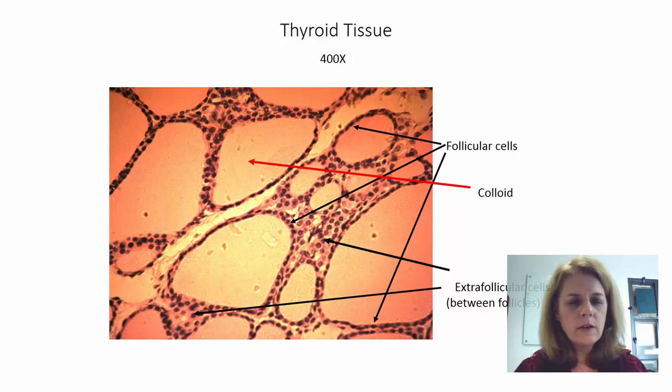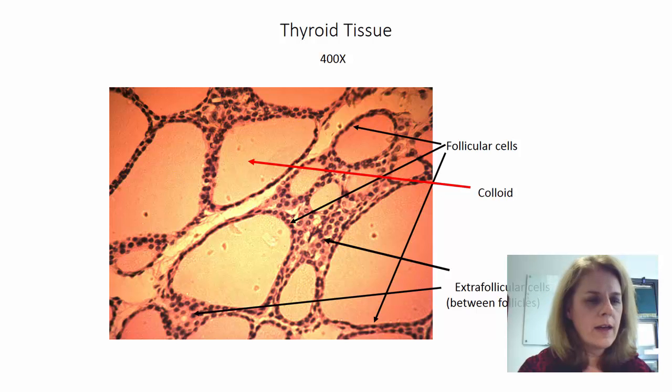Hopefully, or maybe not yet, you've learned what the thyroid does. It makes T3 and T4, and you're going to learn how iodine is added and how thyroid hormone is made. But it all occurs in the thyroid in these things called follicles. Like I said, you may or may not have watched this yet, but here you have a follicle.